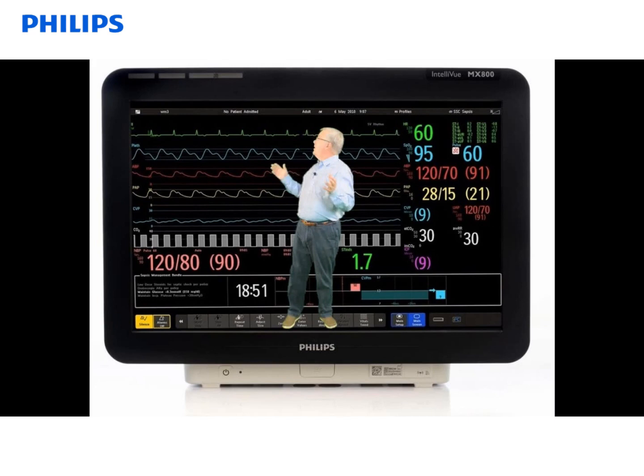Welcome to the MX series Intelliview patient monitor. We'll start by talking about some of the features that are common among all the Intelliview MX monitors.